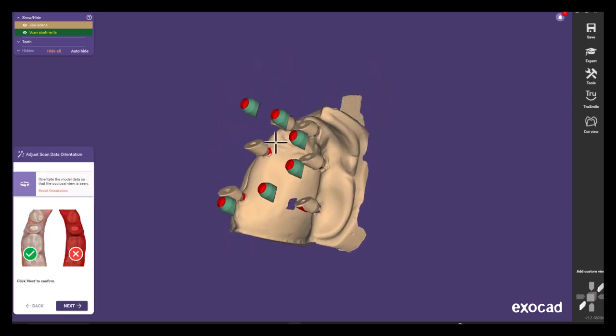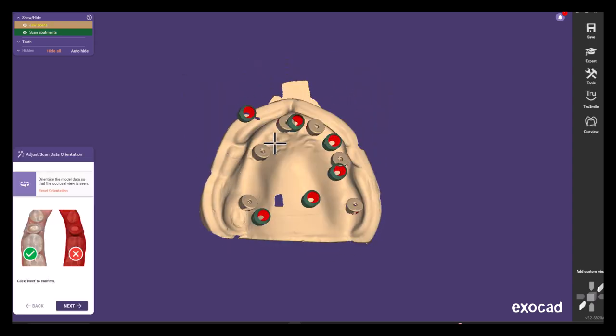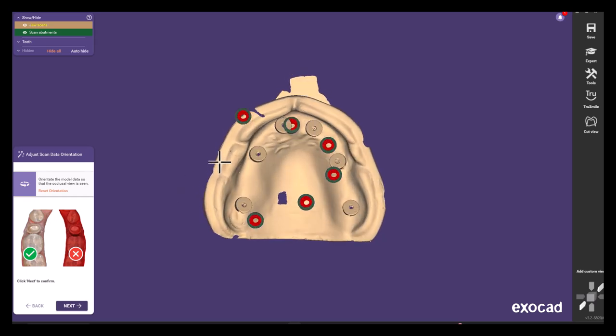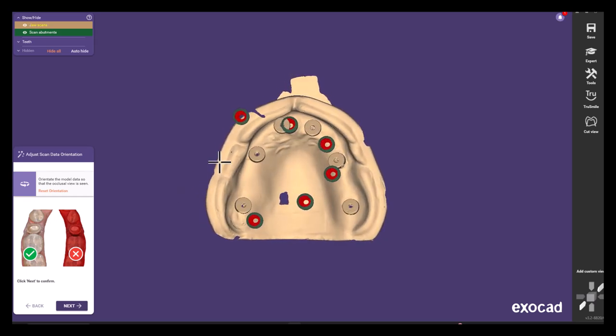As you can see the alignment is not quite right, but this can be easily fixed through the expert mode.